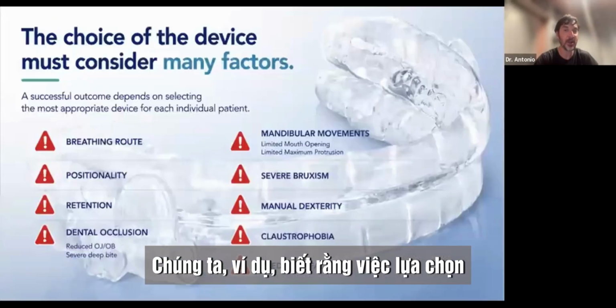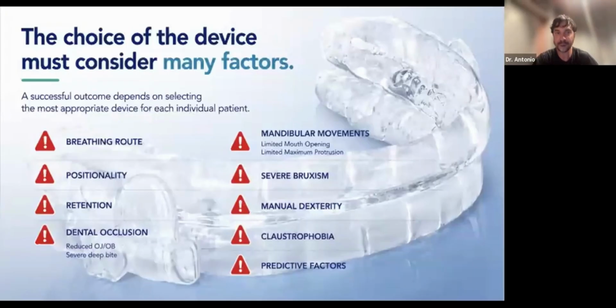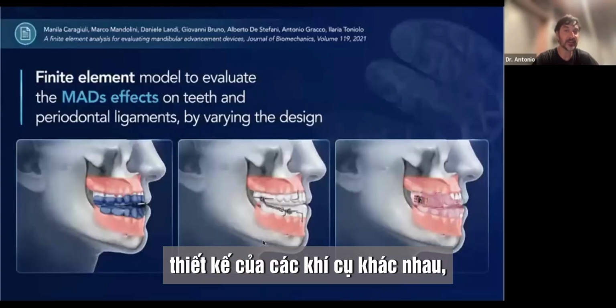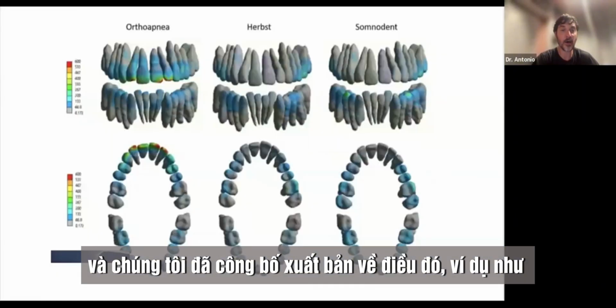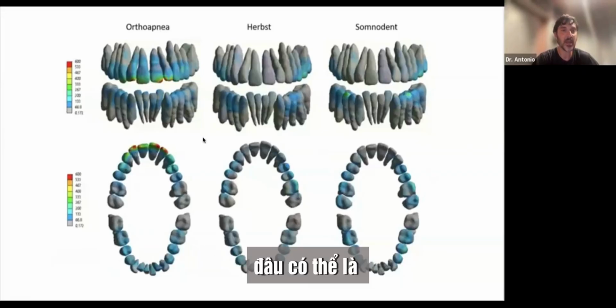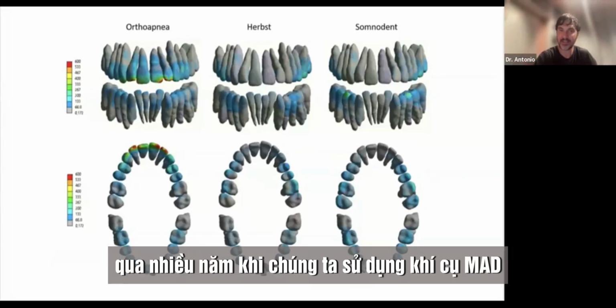We, for example, know that the choice of the right device must consider many factors. And we studied the design of different devices and we made a publication about that. For example, showing with FEM analysis what can be the unwanted movement of the teeth over years when we are using the MAD device.